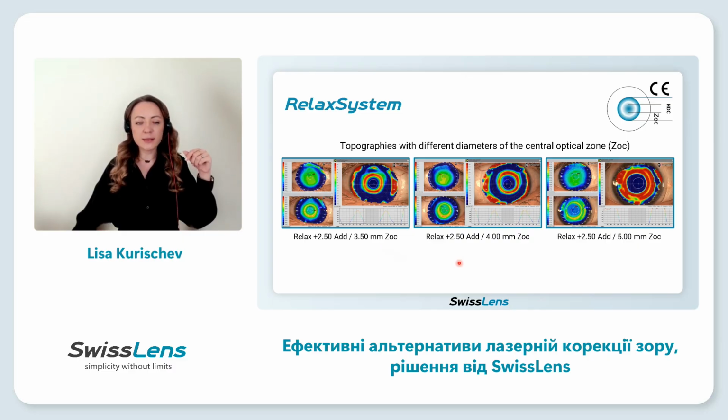And this is a nice tip for you. When you do the topography with the lens, you can see where the lens is stabilized. So where is the optic zone? Sometimes we do fittings and we see it's all fine, but probably the zone is not correctly located. And like this, you can check it and improve your fitting.